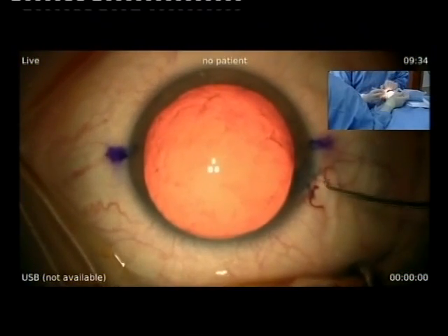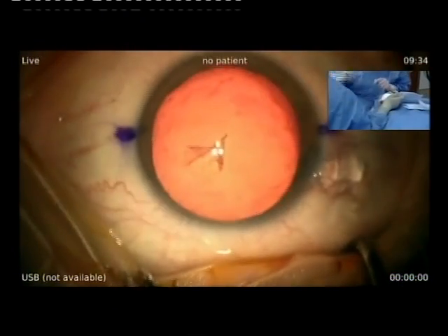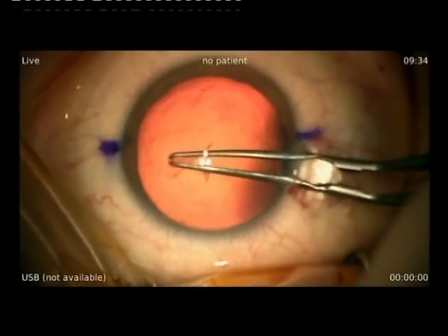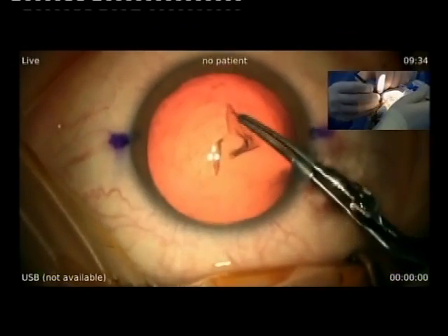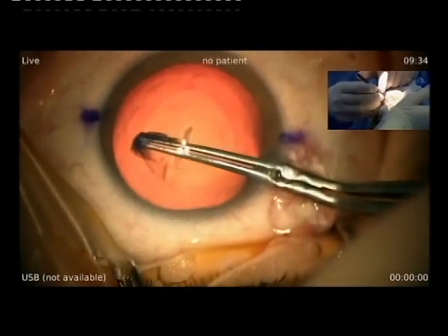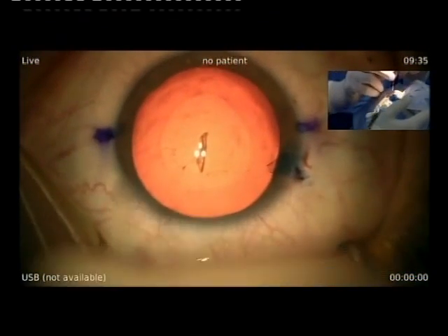I started with a needle. Very nice round shape — capsulorhexis. I make two little incisions.